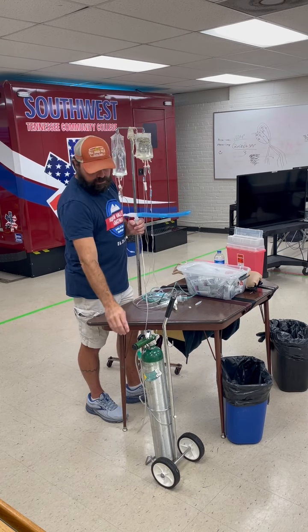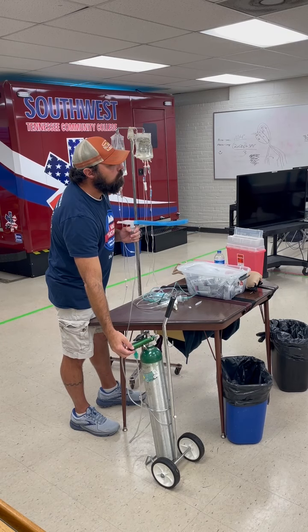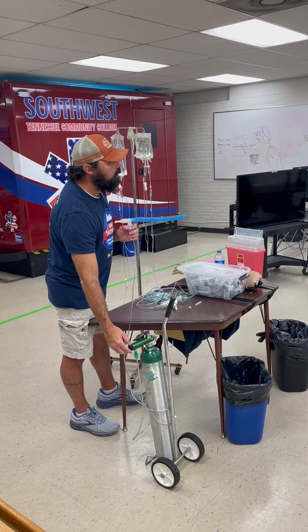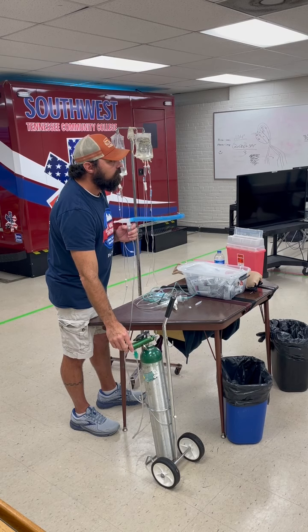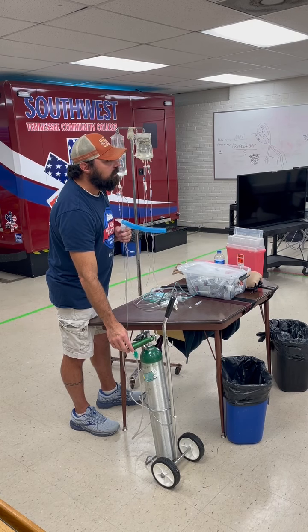Now, what do you set your oxygen at? It's a range. 10 to 15? I'm waiting to hear it. I'm going to let y'all keep guessing. 4 to 6? So your top number's correct. 2 to 6. 6 to 8? Top number, 6 to 8. 6 to 8 is the range.